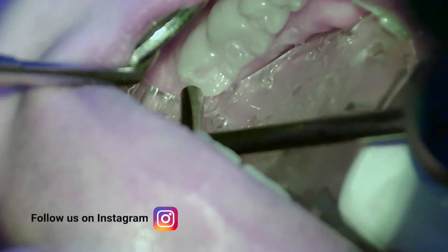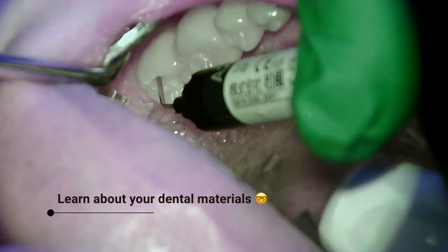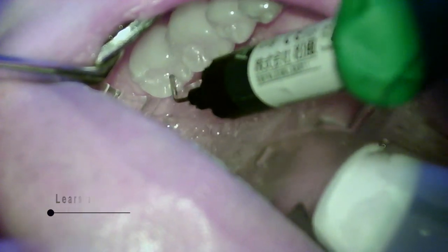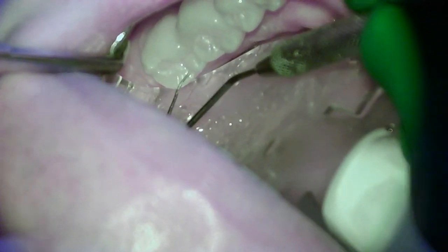I want to highlight something that Gabby and I are always reinforcing: you have to know the dental materials being used in your office. If you don't know about a specific product, make sure you always read up on it and know how to use it — including setting times — so that it's easier when you start setting up for the procedure chairside.